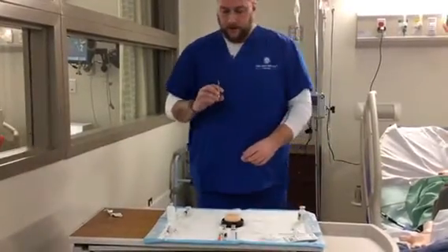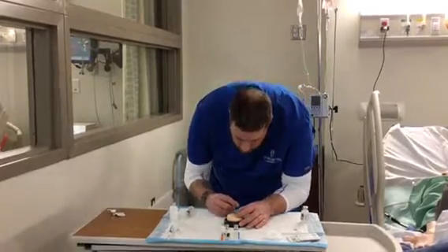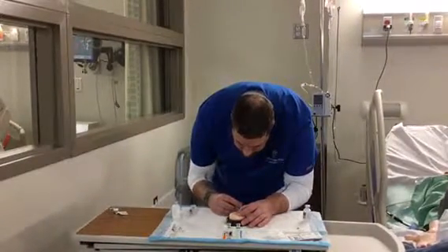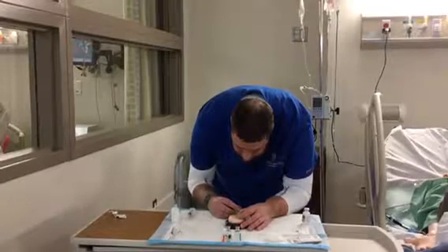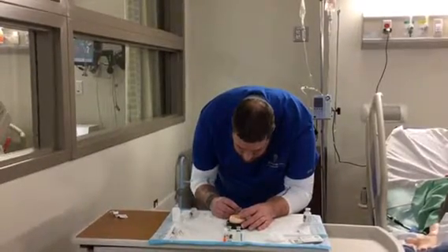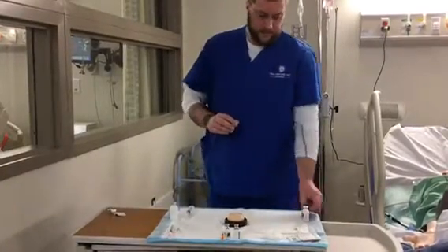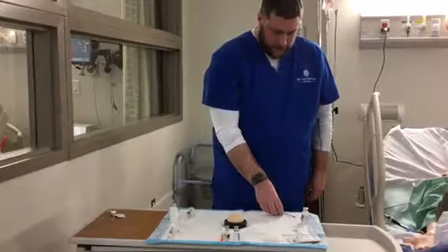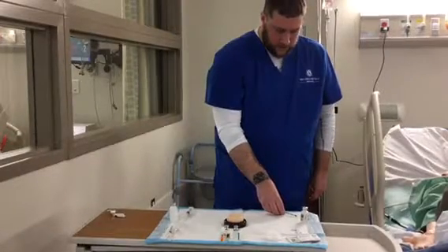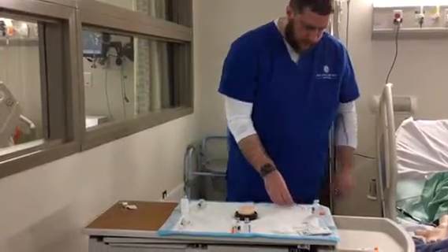For this one here, with the bevel up, you want to pull the skin taut, and you want to go in at about a 15-degree angle, just under the skin, and you want to inject so that you get the nice bubble under the skin. Making sure not to recap, you would discard the needle into the appropriate location.